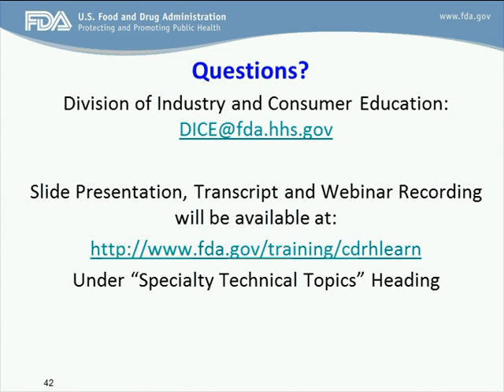Yeah, this is about the cleaning procedure. I'm actually a chemist who has worked in the field of chemical detergency for many years, and I think it's well accepted that the cleaning chemistry for ultrasonic-type cleaners has not been optimized for cleaning medical devices. They're typically generic enzymatic-type cleaners that were designed for other cleaning applications. I was wondering if the FDA is going to make recommendations on specific cleaning chemistries that are better suited for removing biological debris.